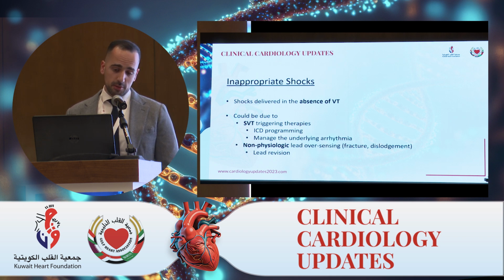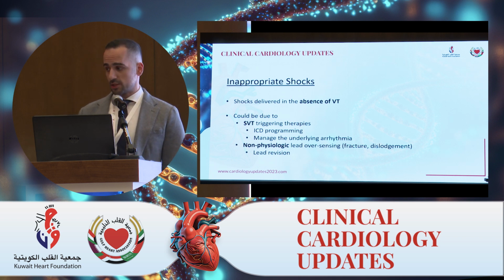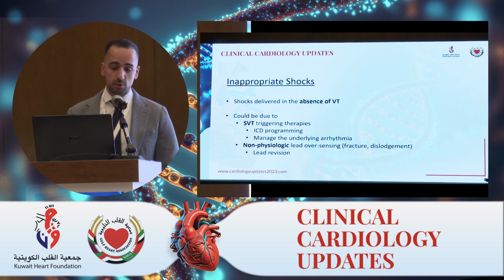Inappropriate shock is defined as a shock delivered in the absence of VT, because like I said, these devices are implanted to save lives and treat VT or VFib. This could be due to, as mentioned previously, SVTs triggering these therapies, in which case treating the underlying SVT or maybe reprogramming the ICD is all that is necessary. However, sometimes problems with the lead, fractures, dislodgement, can lead to non-physiologic noise that will trigger ICD therapies, and in this case, the lead will need to be revised or completely changed.